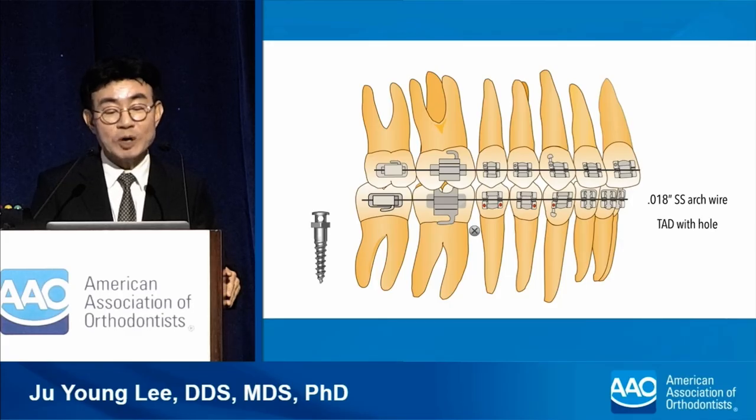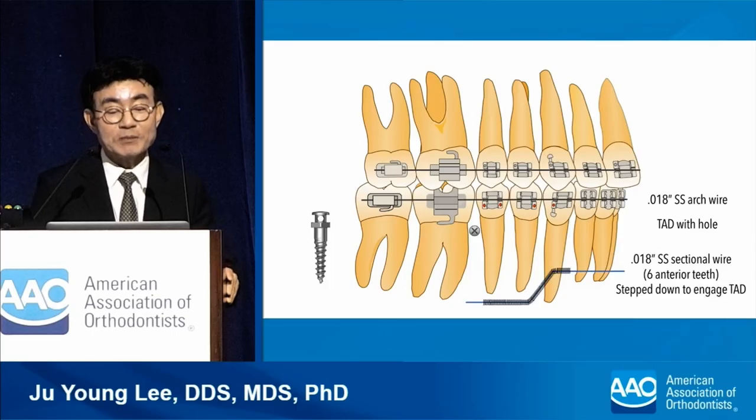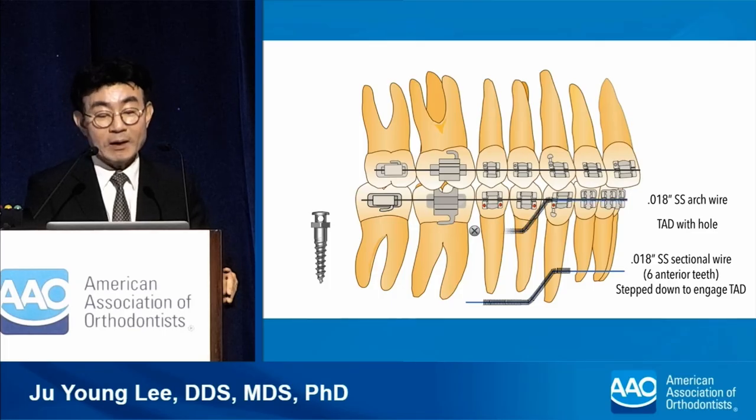First, the TAD with the hole-type head is installed in the posterior area of the mandible. During the installation, the direction of the hole is adjusted horizontally so that the wire can be inserted into the TAD like a molar tube. Separately from the main arch wire, an accessory wire of the 6 anterior teeth is made with 0.018-inch stainless steel segmental wire, and a step on the band is made on the wire to go through the hole of the TAD. And an open coil spring is placed to give pushing force.